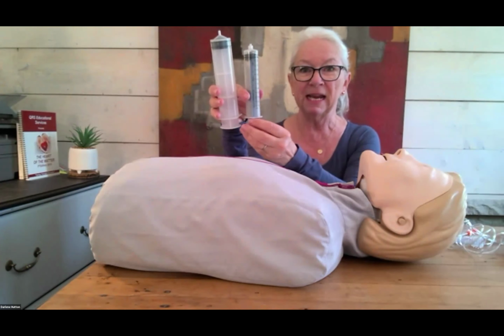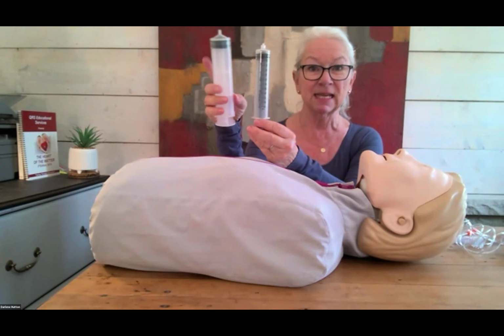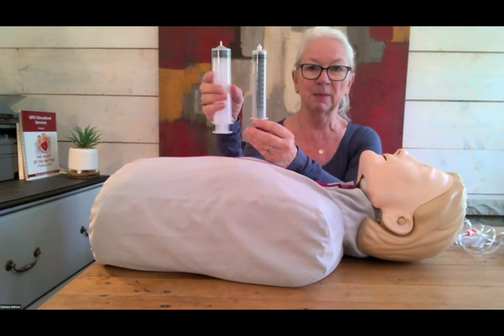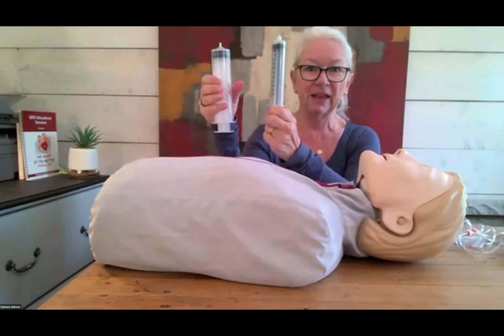If it's a difficult airway and the physician feels that they will not be successful or they don't want to attempt intubating with an endotracheal tube, then the LMA is the next likely advanced airway that most of you will use in a hospital environment. This size syringe here is perfect for inflating that cuff.